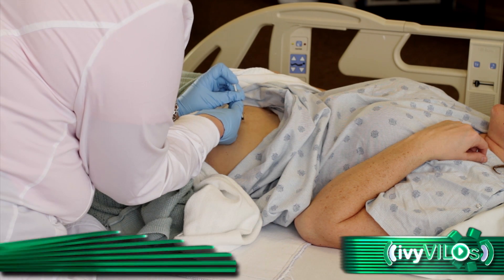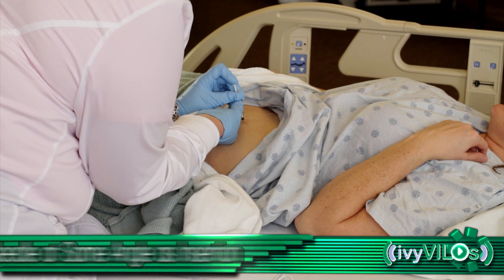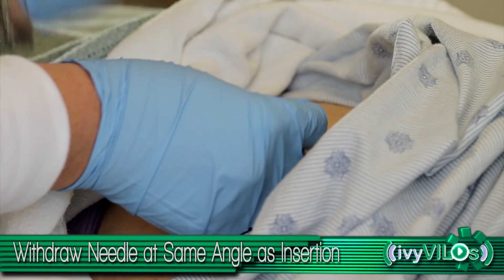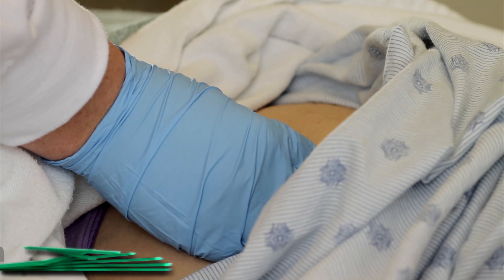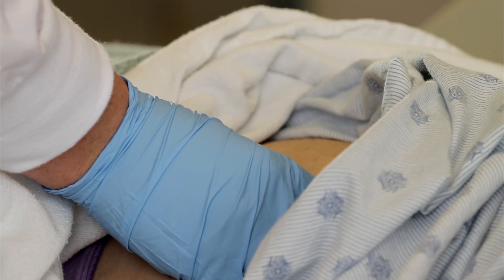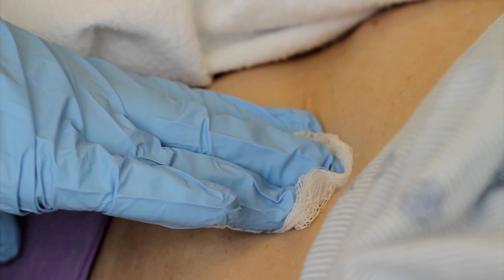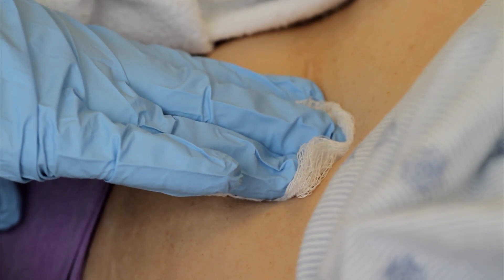Withdraw the needle smoothly at the same angle of insertion. Apply dry gauze with gentle pressure. Do not massage the site.